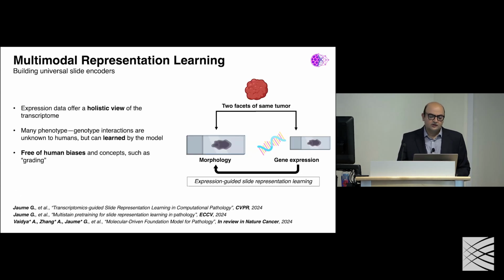And then we assess this on large amounts of internal cancer data as well as on external data. So if we just recap some of the story that I've told, multiple instance learning is the most commonly used paradigm for processing pathology whole slide images into some kind of meaningful learning paradigm, and feature representation is important. And you can use self-supervision to improve feature representation, and then contrasting with additional modalities improves image representation as well.